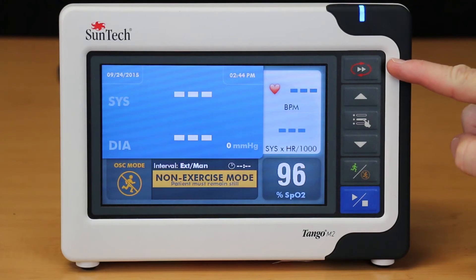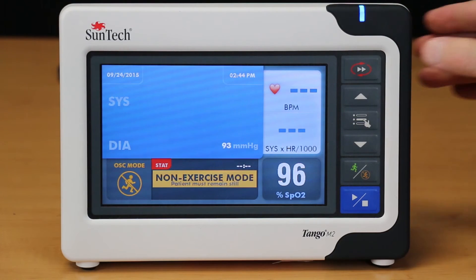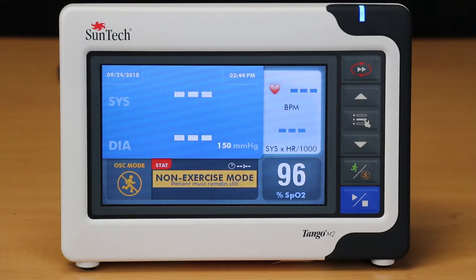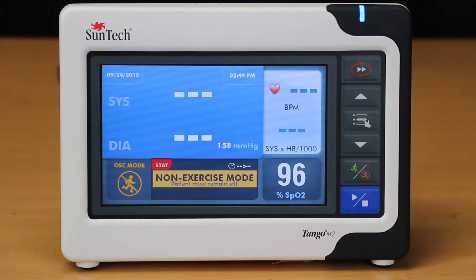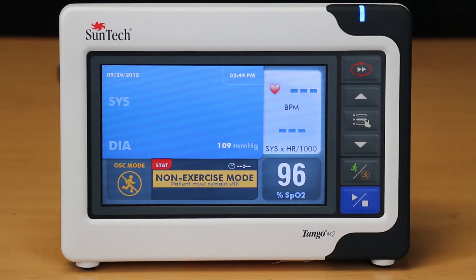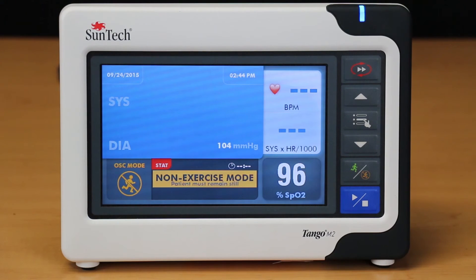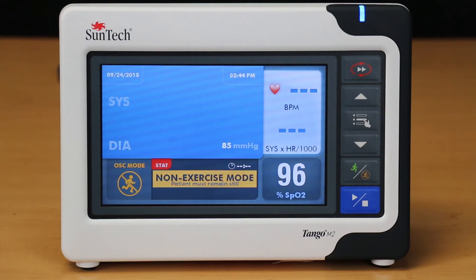The Stat button starts Stat mode, which is critical when repeated BP readings are needed. Pressing this button puts the Tango M2 into Stat mode. The display will continuously flash to indicate Stat mode. Once a reading is complete, the Tango M2 will pause for a few seconds and then take the next reading. The Tango M2 will continue this process until either the Stat button is pressed a second time or it has been in Stat mode for 10 minutes.